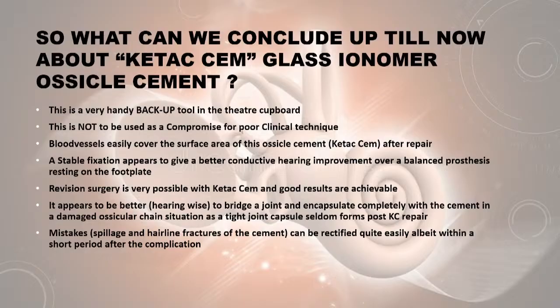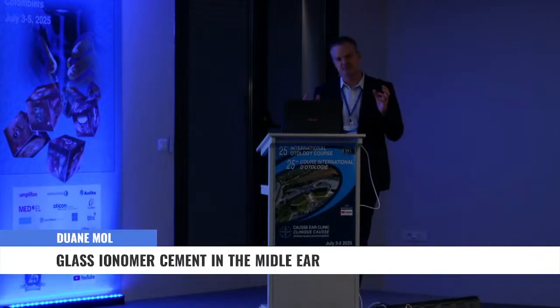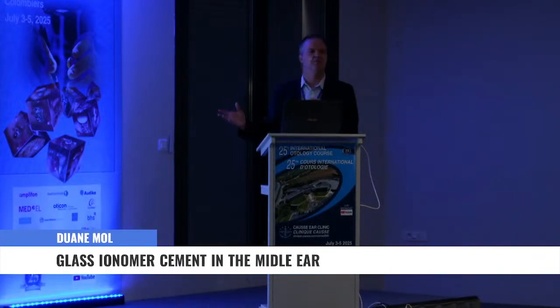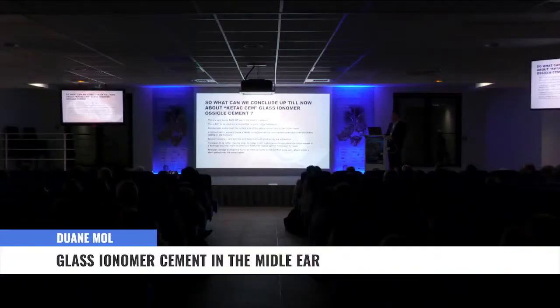Those are our indications, and I want to stress this is a backup tool in theatre. It's great to have it, but don't make it your primary method. If you open an ear in South Africa, we don't have the privilege of having 17 different prostheses that we can choose between. So it's a very nice extra benefit to have this in the cupboard, so that if I open an ear and there's something I'm not too happy with, I have a type of prosthesis that I can use by using the cement. It shouldn't be a compromise for poor technique. As you can see, revision surgery is very possible, and mistakes can be quickly fixed.